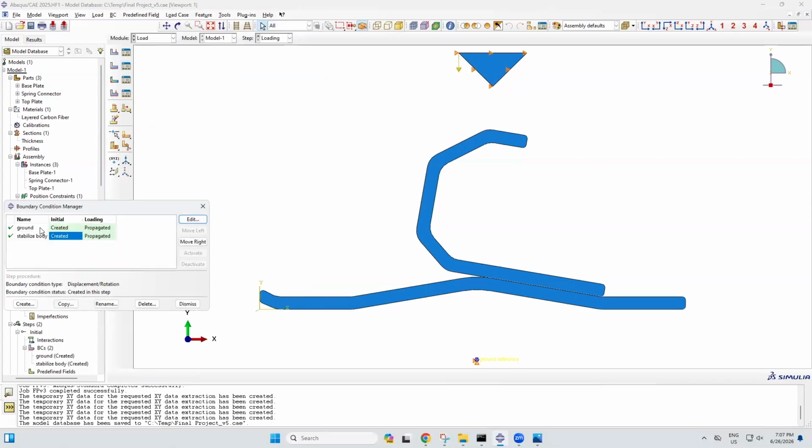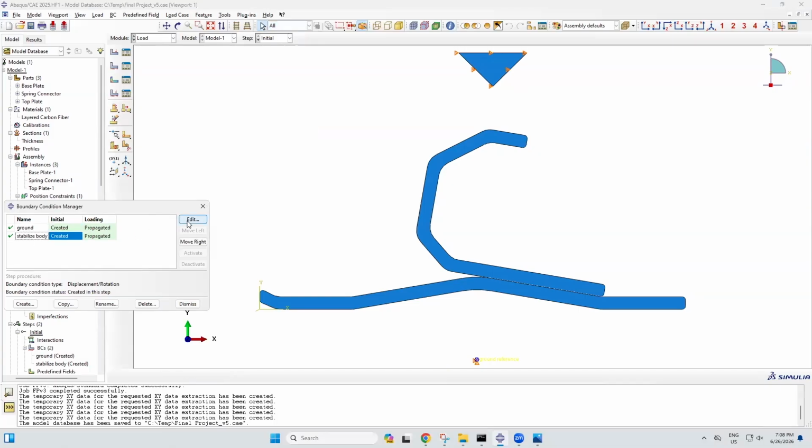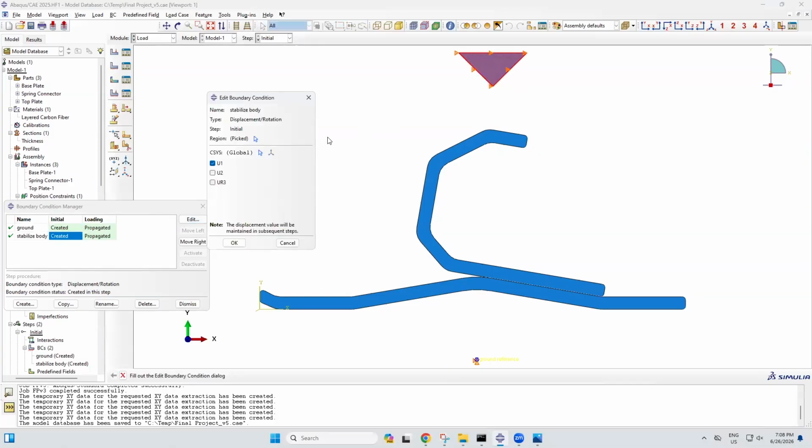Next are the boundary conditions. The first boundary condition I created was the ground, and I selected the ground reference point where I constricted deformation in the vertical, horizontal, and rotational directions. The second boundary condition I created was to stabilize the spring connector. This prevents the spring connector from moving left or right and forces the part to only move up or down.